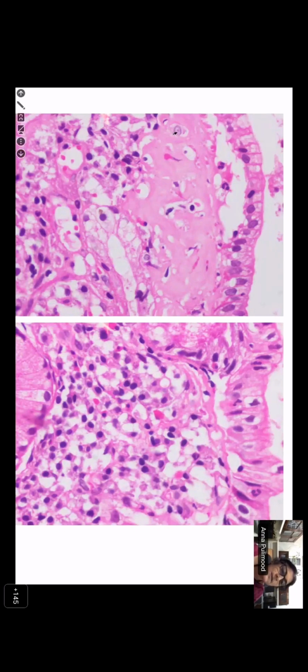Inside the deposit, can you see some cells? That's a fibroblast. Maybe there's a fibrocyte. This may be actually a blood vessel inside that. This also may be a blood vessel inside that pink material. Do you see cells and blood vessels inside amyloid deposits? No, ma'am, it's acellular eosinophilic. You never see cells and blood vessels embedded in the amyloid. You can have amyloid in the wall of a blood vessel. You will never have capillaries lying inside a large mass. Usually not. Never say never.